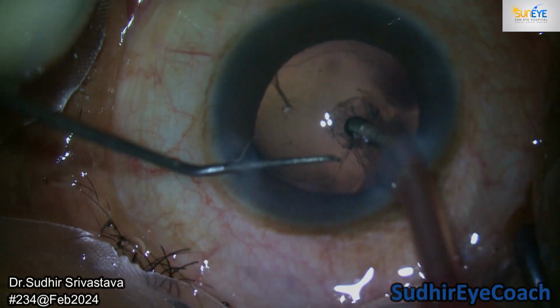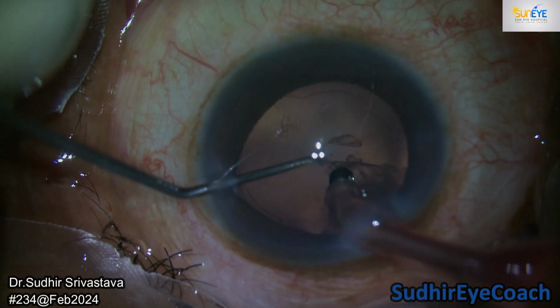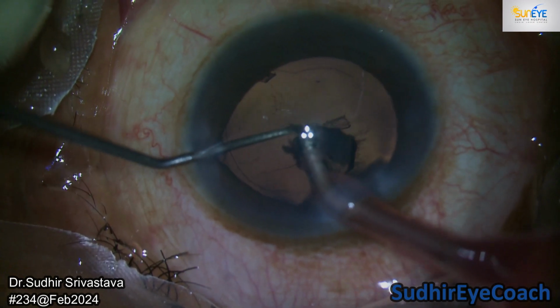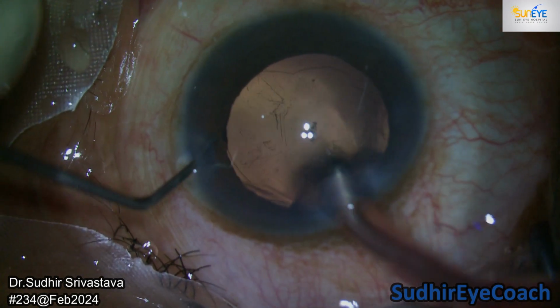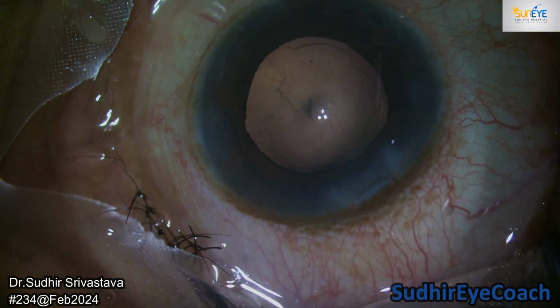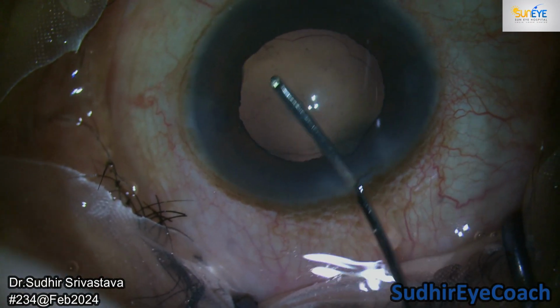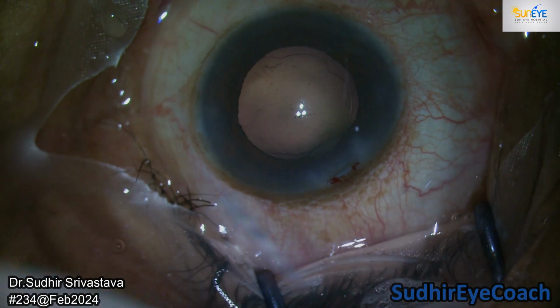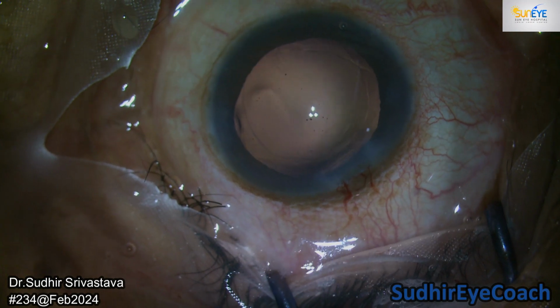Again, I'll say that visualization is very, very important, and all the maneuvers should be very gentle and not in a hurry. Almost in every case I use this BSS flush to remove the cells and fibers present on the posterior capsule, and it gives me a lot of satisfaction.